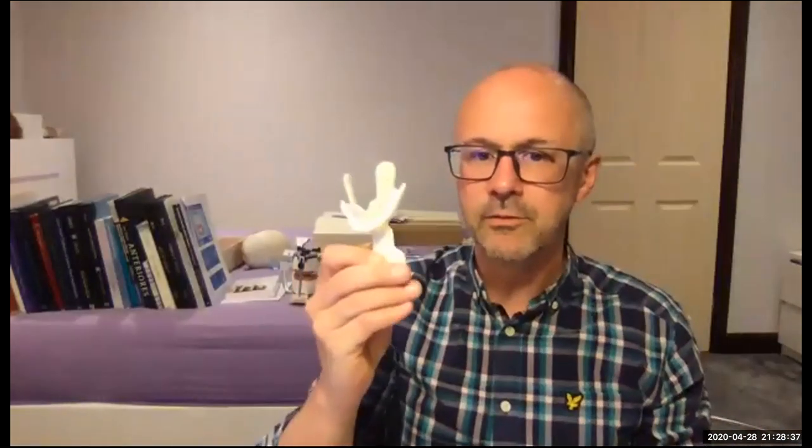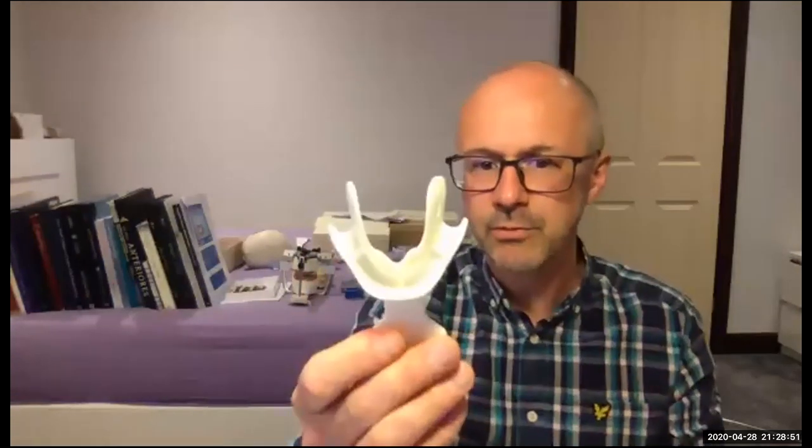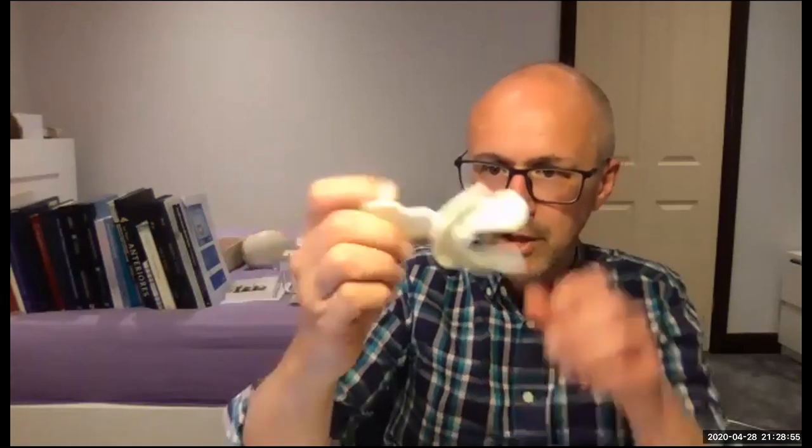So Tony Bon, can the cutback tray replace the 2-tray system for the lower mandibular impression when using the cutback tray and when using the 2-system tray? Thank you. Now, Tony, if you remember, this is for Bert, I did a primary impression, but I didn't use that because this cutback tray here is designed for the edentulous mouth. And even though it looks a little bit like a stock tray, I wouldn't be able to get it over those front teeth there. So I just used a standard lower stock tray in there, and did that for my first part, and then the second part using the 2 parts. So to be blunt, Tony, no is the answer to that question.